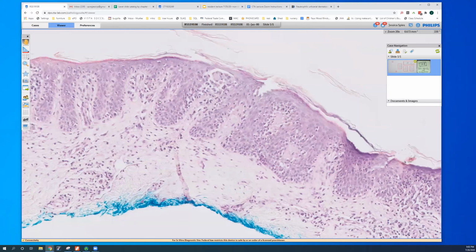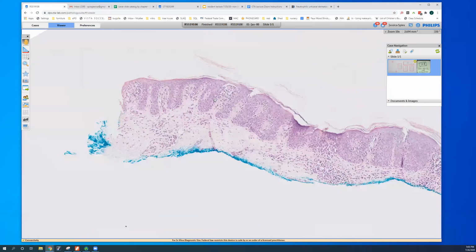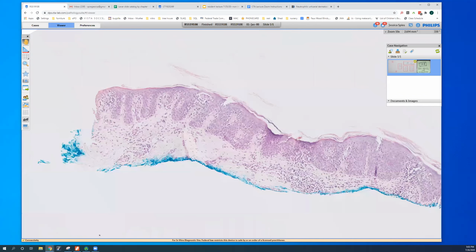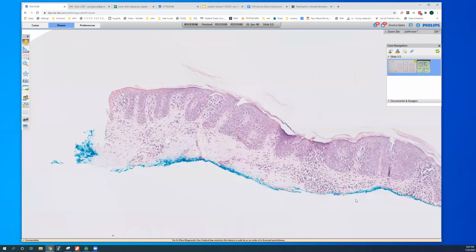They've done lots and lots of studies on what is the most sensitive histologic feature in mycosis fungoides, and it's the lymphocytes with the halos, aside from the epidermotropism. So this is a beautiful example, and you can see they really like to hug the basement membrane. They like to line up along the DEJ here, like little soldiers.